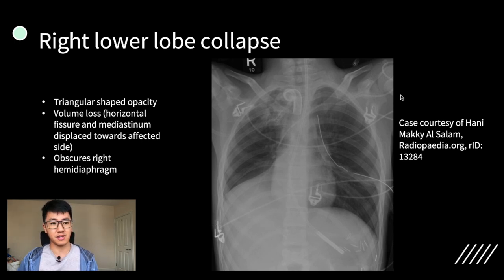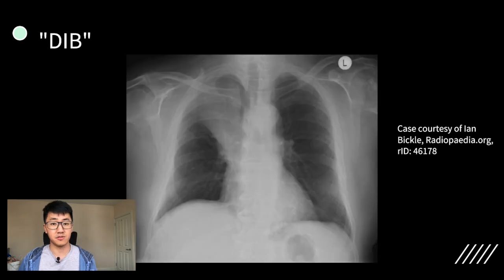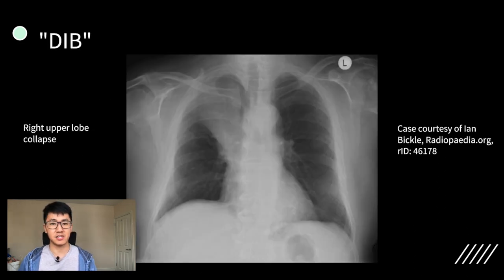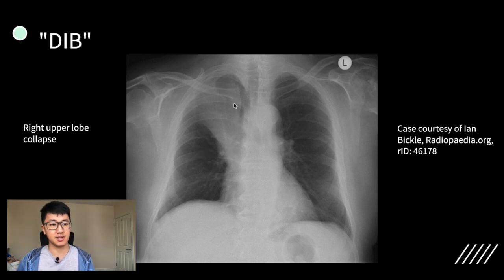The other really important thing with every radiograph is to look for lines and tubes. This patient has a tracheostomy, a PICC line, a left-sided chest drain, and a nasogastric tube. Next case — so this is a classic example of right upper lobe collapse. Again, you have a triangular-shaped opacity with the apex pointing towards the hilum. The right upper lobe, when it collapses, tends to go upwards.